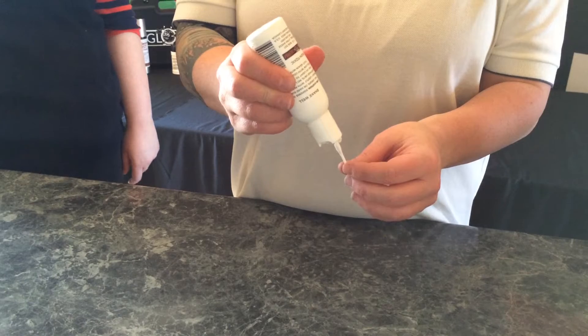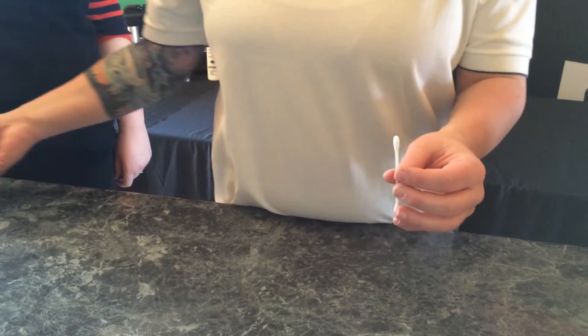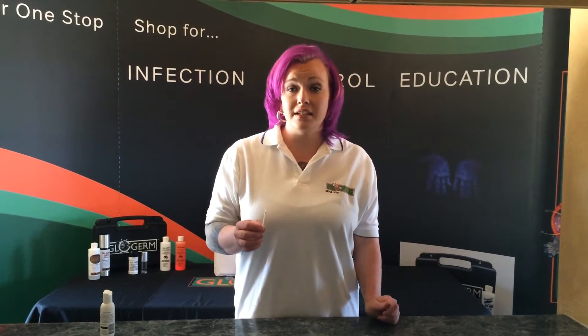First we're going to apply a pea-sized amount of surface cleaning gel to the top of a Q-tip. Next you're going to apply the gel to any area where you would like to test cleaning practices. Please remember that it should be a non-porous surface.